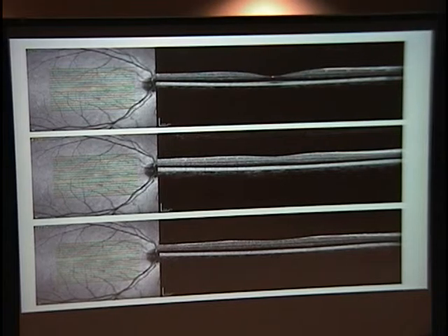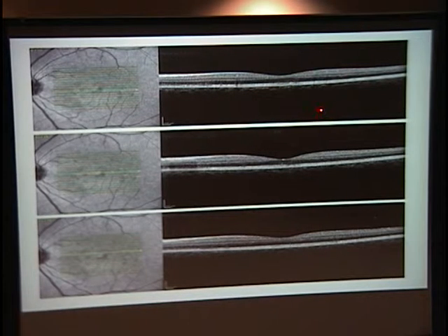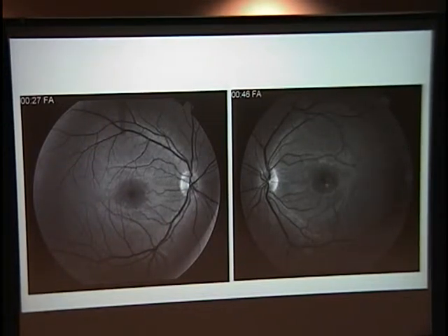Here's the OCT from the right eye on initial presentation, and it looks great. There's really no abnormalities seen there. And here's the left eye. You'll notice just some subtle changes here at the level of the RPE. There's a little indentation with some loss of the ISOS border junction just above that. And again, you can see that here right through the central cut through the fovea. Red-free images, again, show what we've seen.